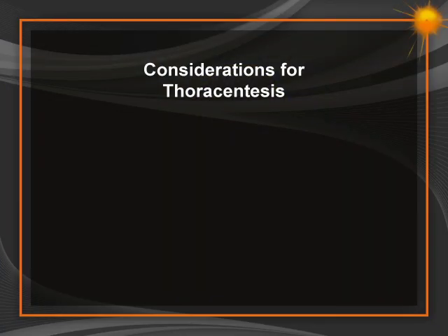We will now review the specific steps required for thoracentesis. It is important to elicit factors that predict difficult thoracentesis. These factors include use of positive pressure ventilation, mechanical ventilation, BiPAP, CPAP, in which there is increased risk of tension pneumothorax if lung parenchyma is pierced.